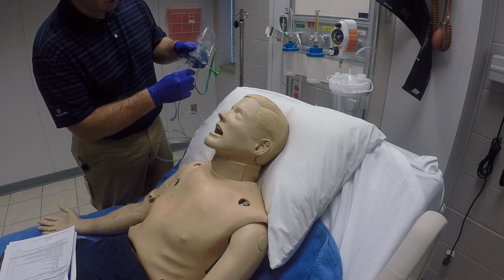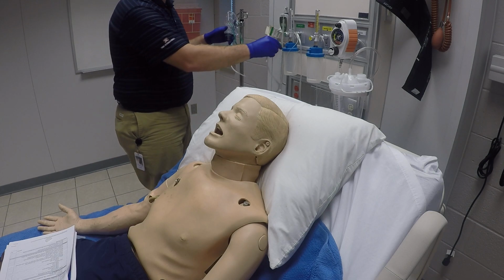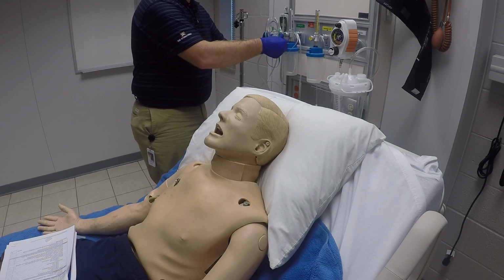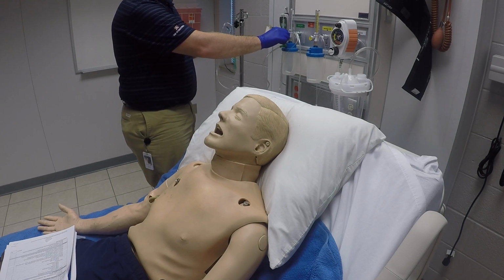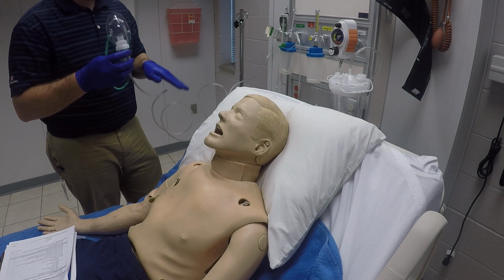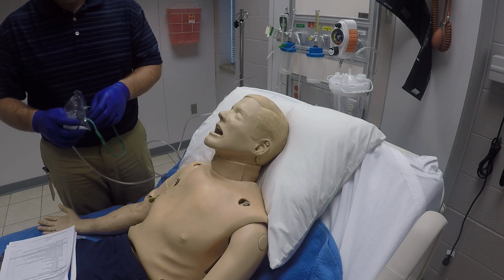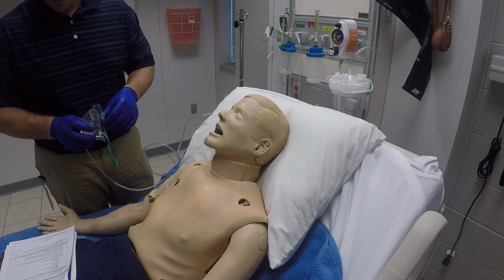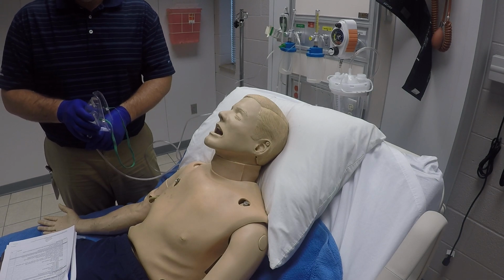We'll attach that into the bottom of our nebulizer unit, and then we can attach it into the wall or into our portable tank, whatever we have available. And then we'll go ahead and set that up on our desired flow rate. Typically you're in the area of 8 liters per minute on a lot of your inhaled medications. That's what you're wanting to set your flow rate at. Of course, we also have our PPE on throughout this whole process.